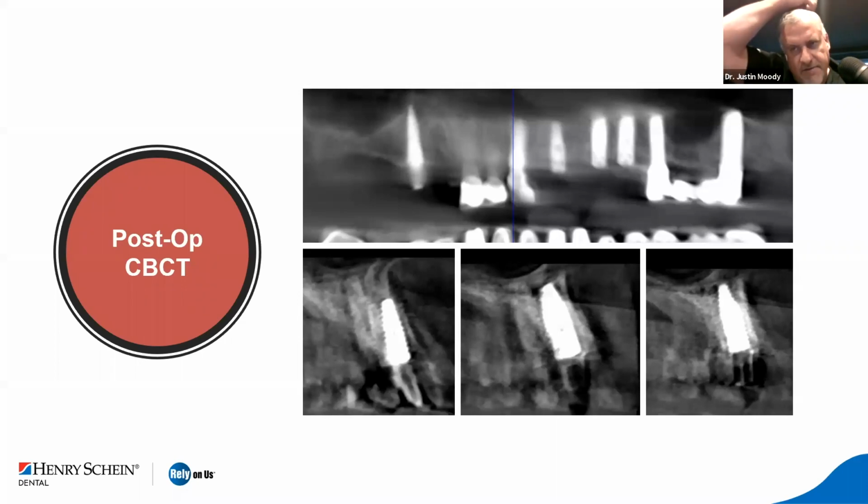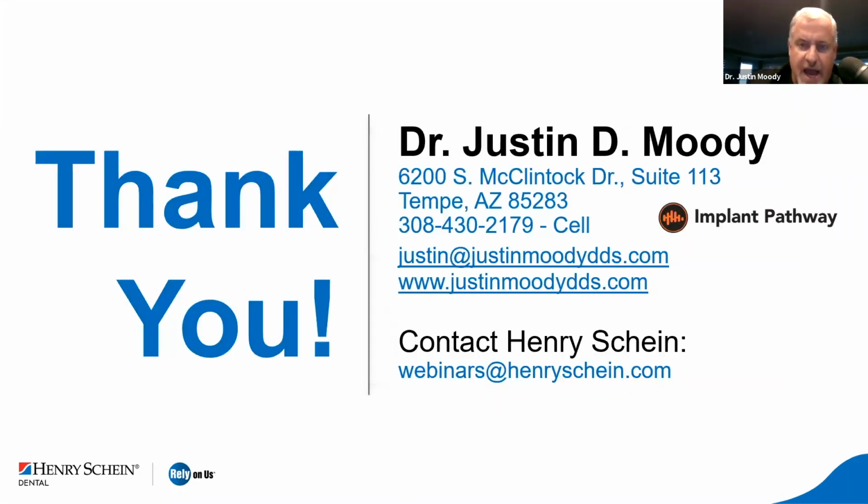So that is our digital workflow as we move through surgical guides into printing. So ConeBeam CT, STL, AIS software, putting them together, implant planning, restoration down. What I didn't show on that software is you can also put a virtual restoration in there to make sure that we have screw access holes and such where we want them to be.